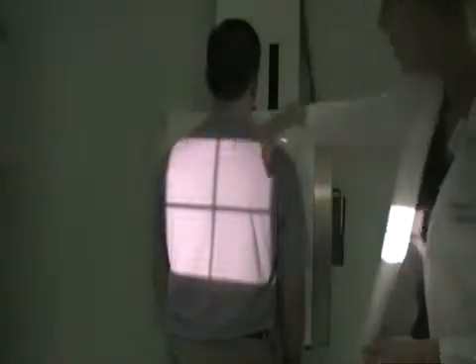Alright, next I'm going to show you the oblique for the ribs if you do have an anterior injury of the ribs. So say we're doing bilateral ribs and we take our first image with the patient PA. For the straight PA you would have the patient's chest right up against the board. Then you would put your cassette in crosswise if they are of any width throughout the chest. And this would be our PA position for the ribs.